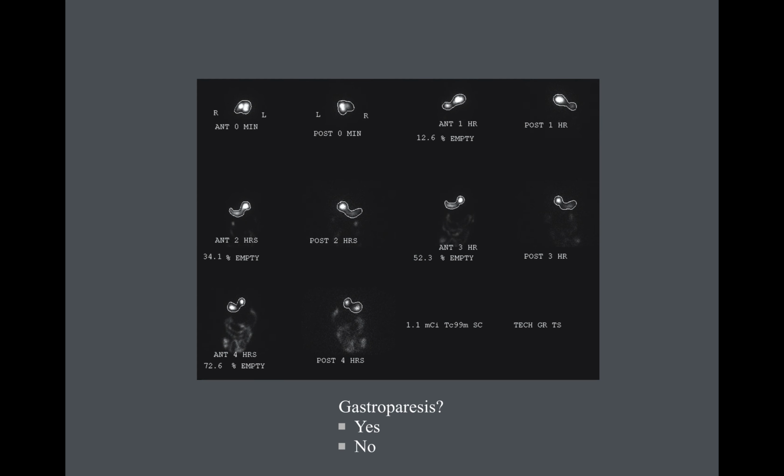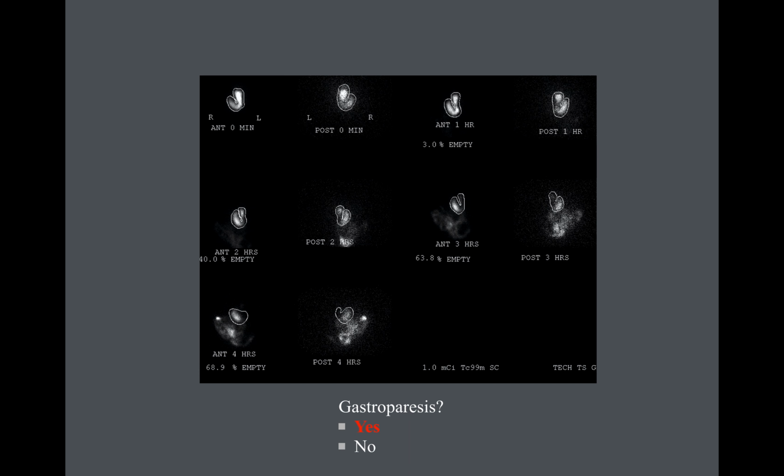Okay, another example, is this normal or abnormal? And I'm sure, again, all of you have correctly answered that this is abnormal, with emptying of 69% at 4 hours. This is, again, below the 90% threshold.